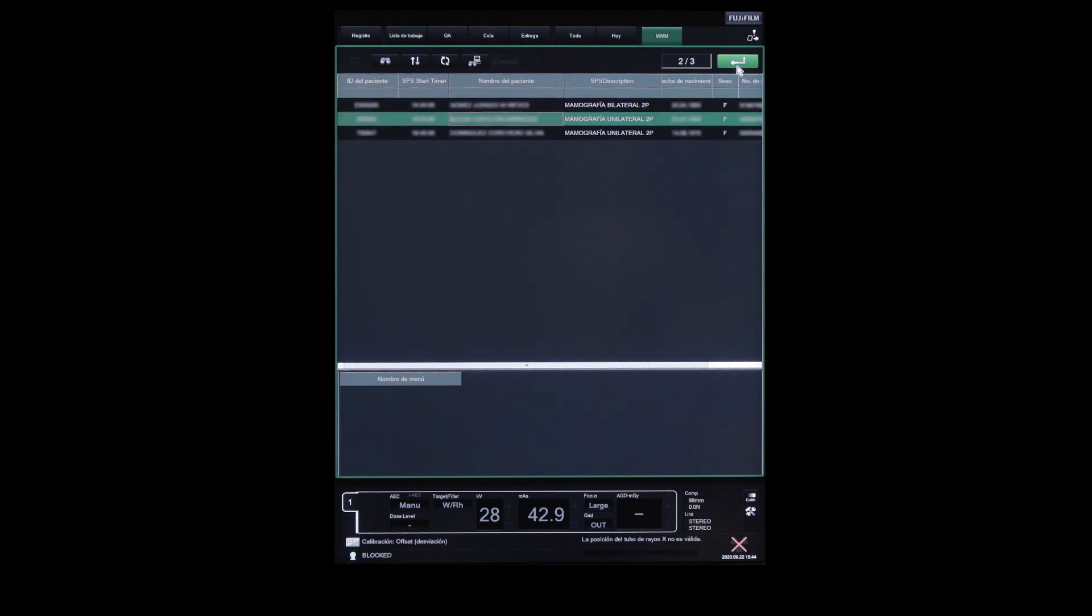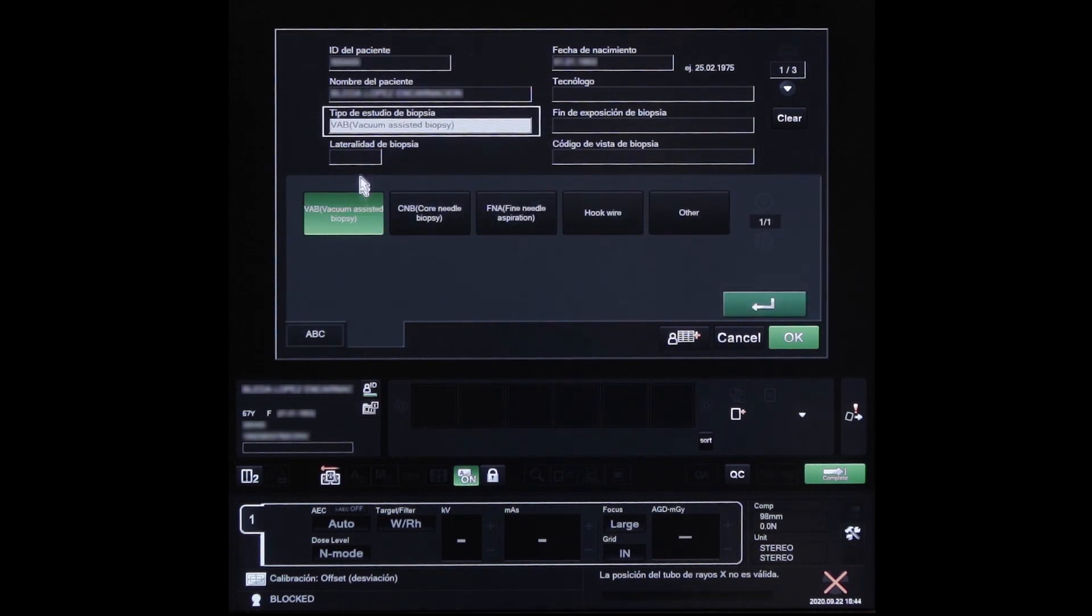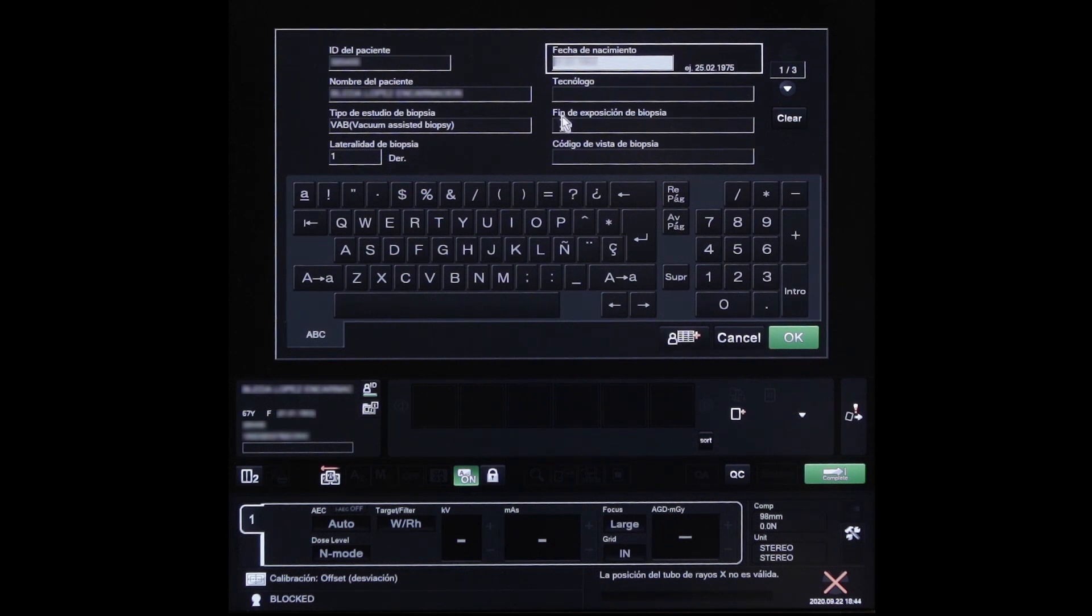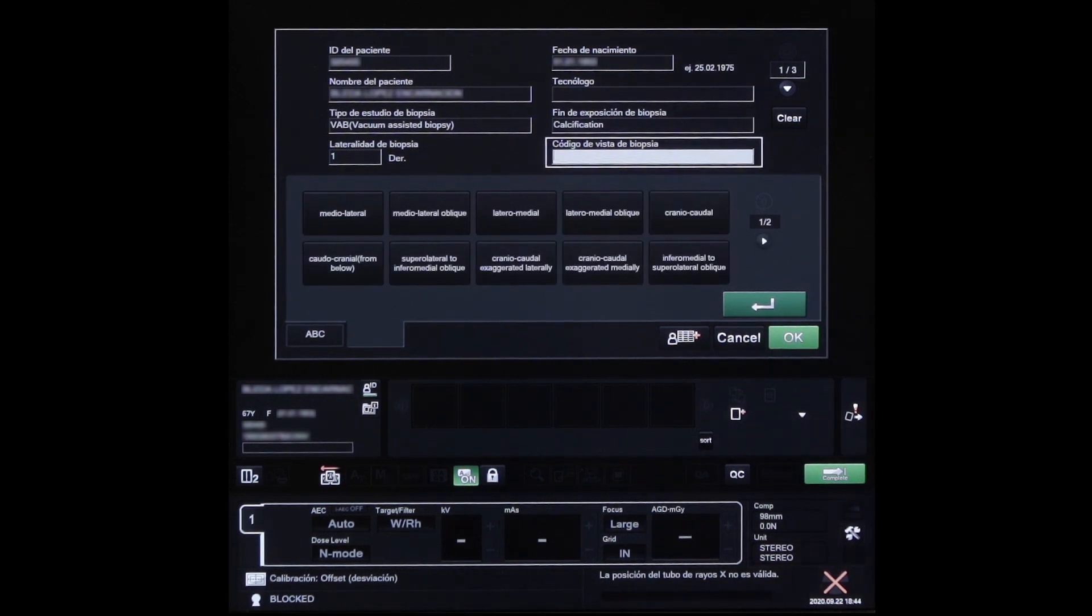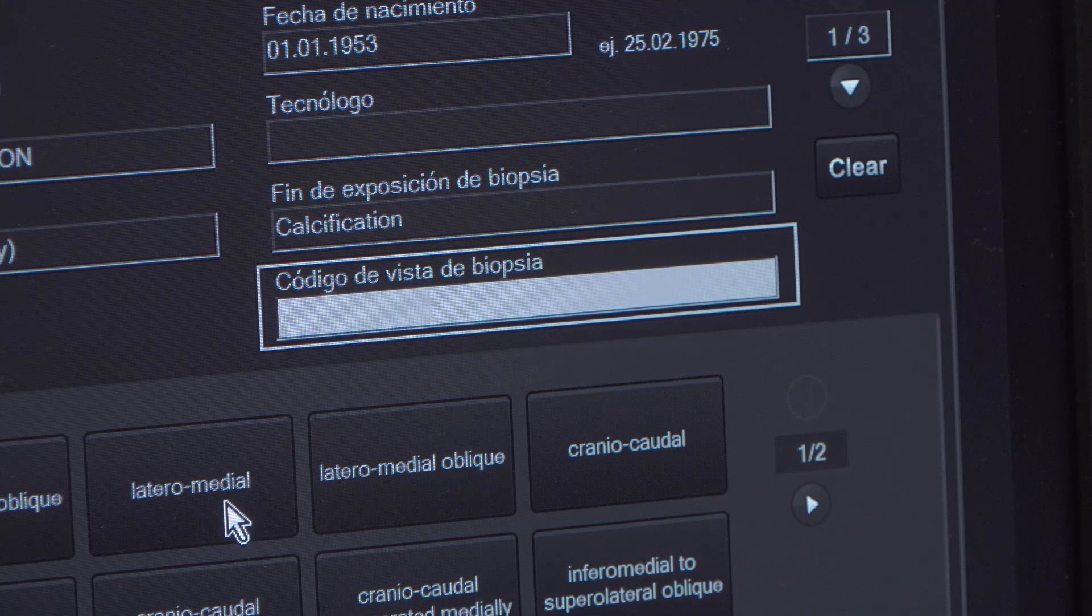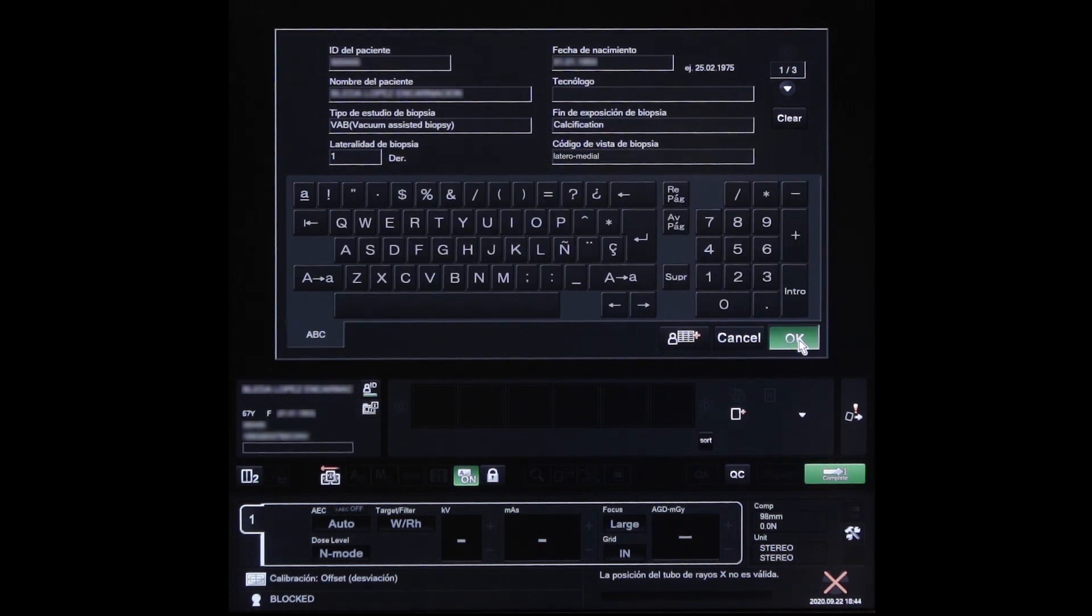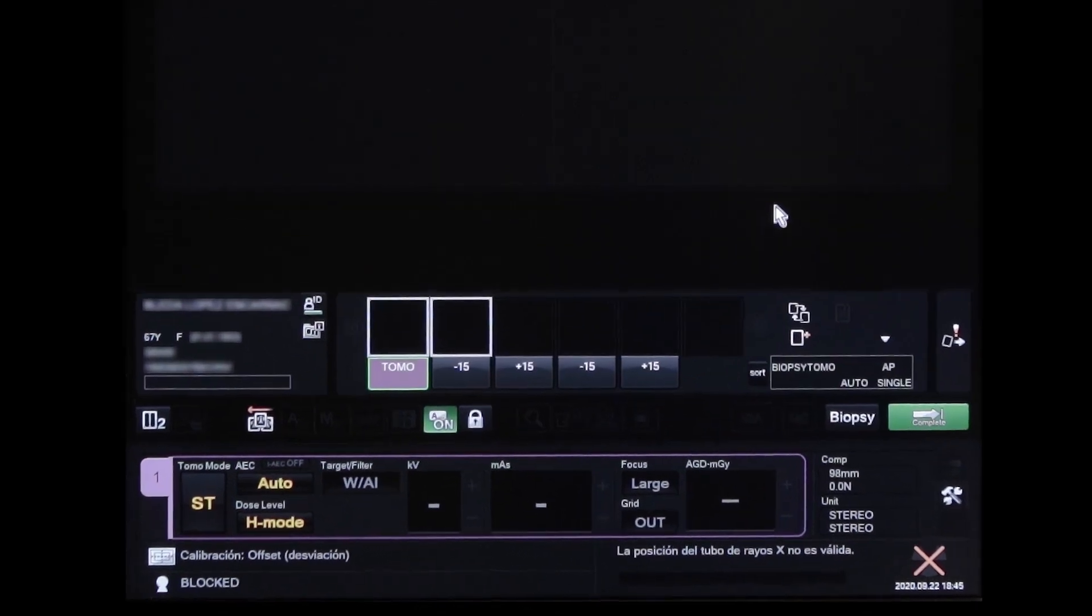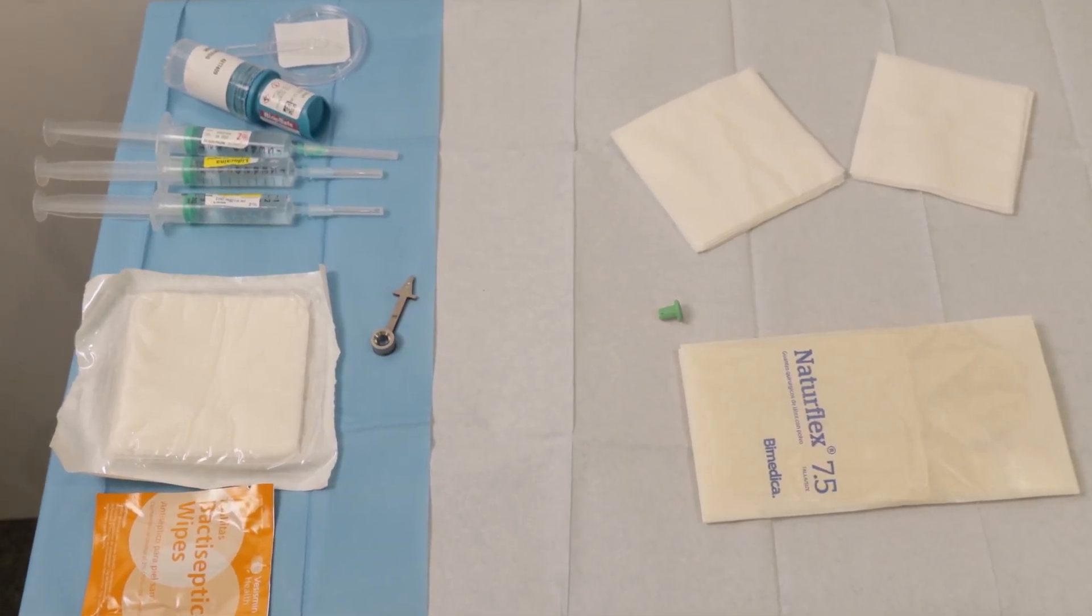Select the patient entry in the work list and add all necessary information as required: type of procedure, breast laterality, type of lesion, projection. Select Tomo Biopsy Protocol and add a stereo pair. Start the biopsy exam. All materials needed for the exam must be prepared in advance.